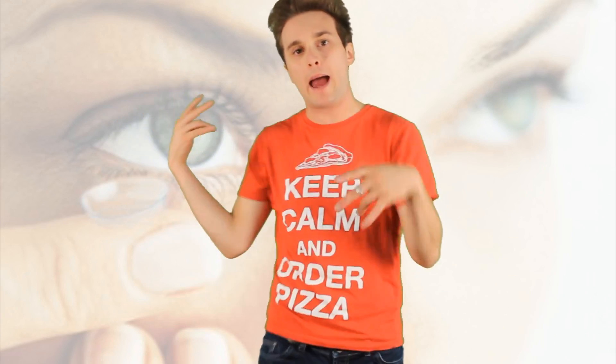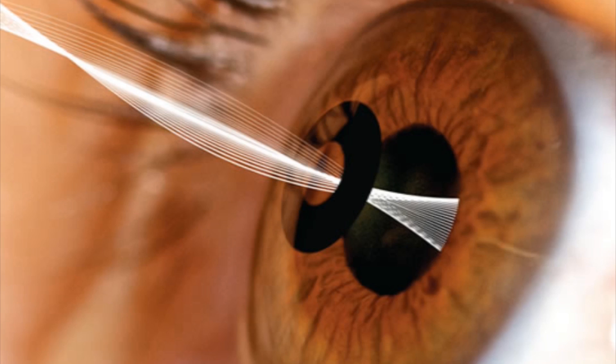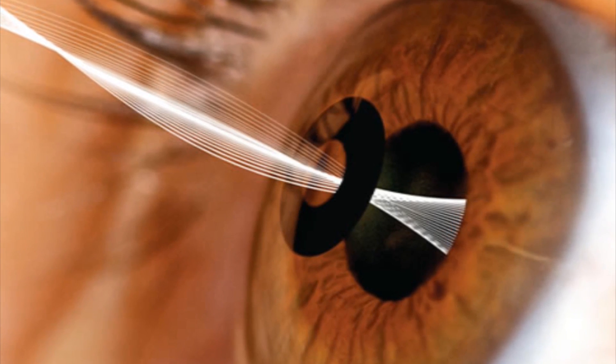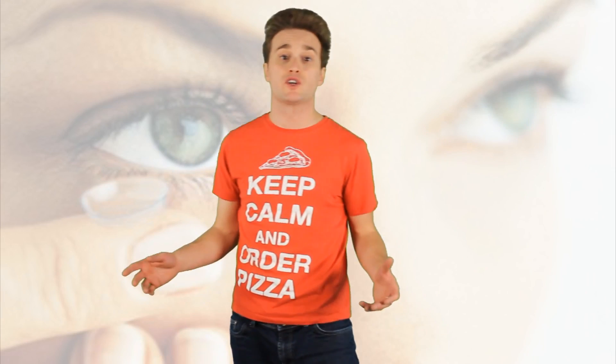Do you guys wear glasses? Let me know. Do you think glasses are cute or not? Karma inlays — it's developed pretty much a contact that can be put into your eye. It's an implant that will help remove blurry vision and help you see a heck of a lot better.